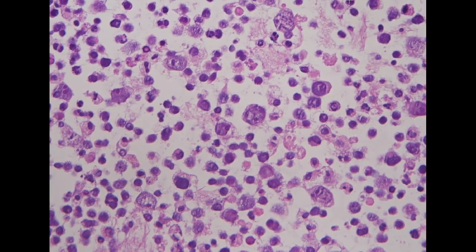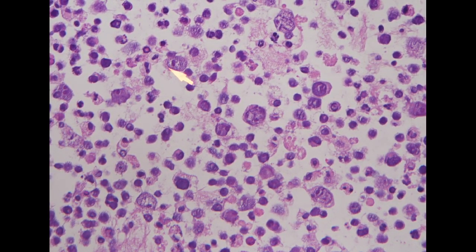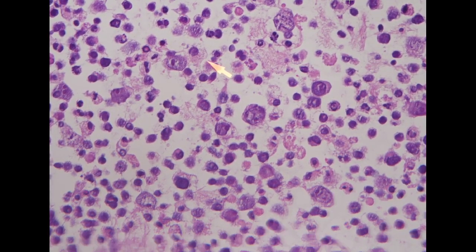Just to check, we know that these bigger cells are more likely to be poorly differentiated carcinoma. However, how about these intermediate-sized cells? This also looks atypical. So just out of curiosity, we can confirm that this is likely an epithelial origin. But with very poor differentiation, most of the cells present as single cells.